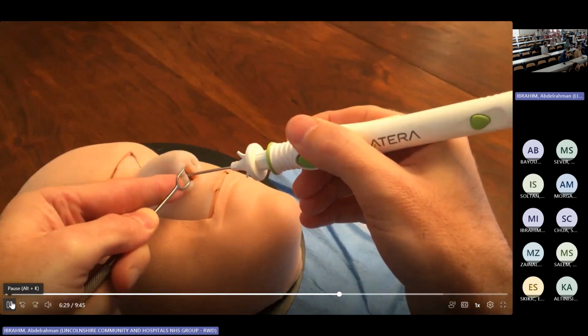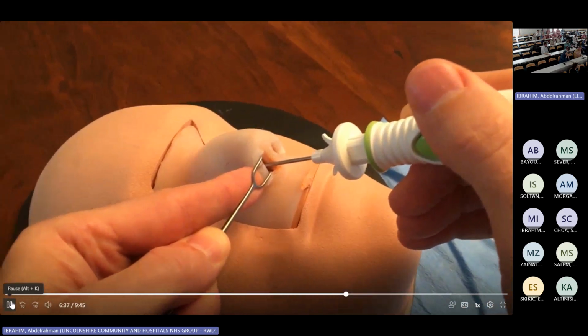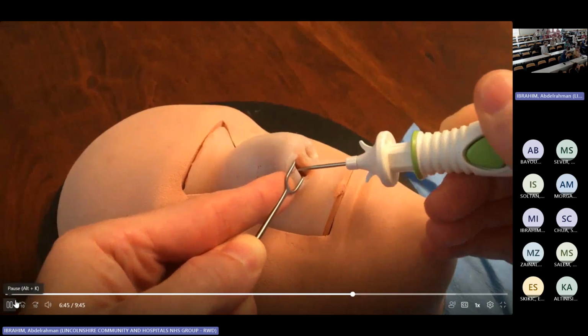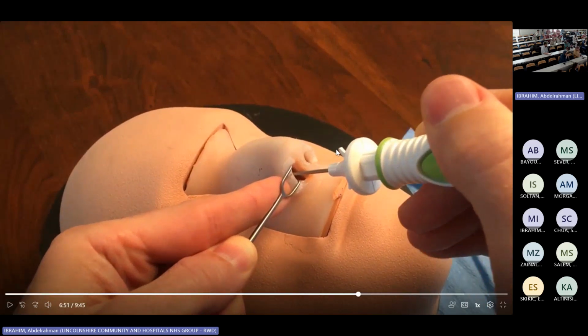So I'm going to keep that counter traction with my double prong skin hooks, pulling back, and I'm going to slowly advance the cannula. So this should be like pushing the cannula through butter. Every now and then I'm going to lateralize to see where my needle's at. I'm going to continue to advance. And you can see the direction of those forks is the same direction of the skin of the vestibule. Okay, so those are the leads for yourself. Do not make it more rotatory inward or lateral, because this will make the position of your implant incorrect. So make sure that those forks are in the same line with the vestibule lines, which is the main curve of your nose.